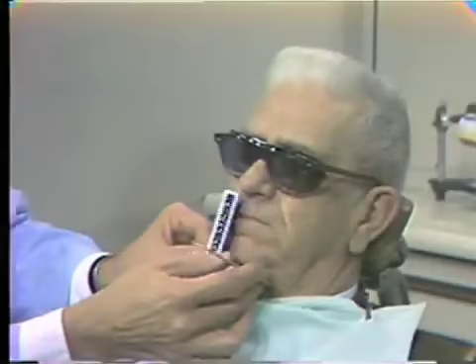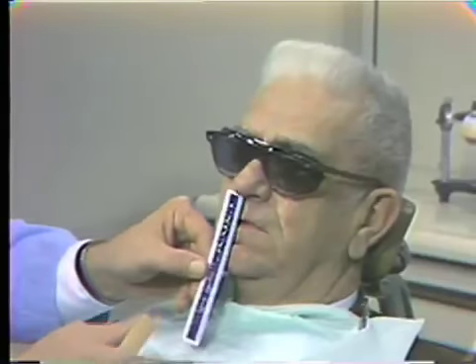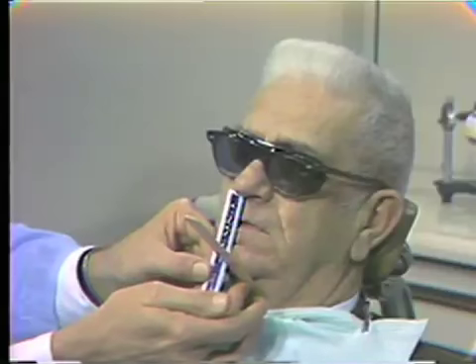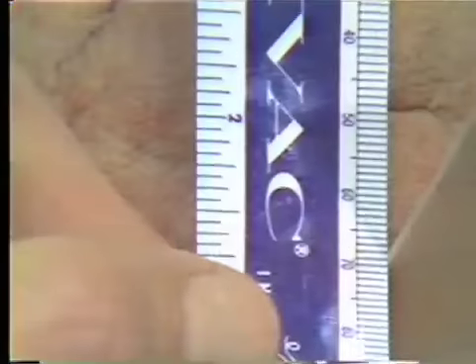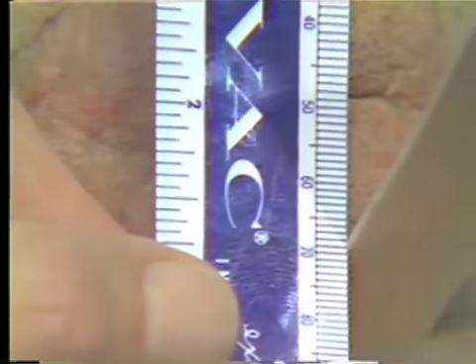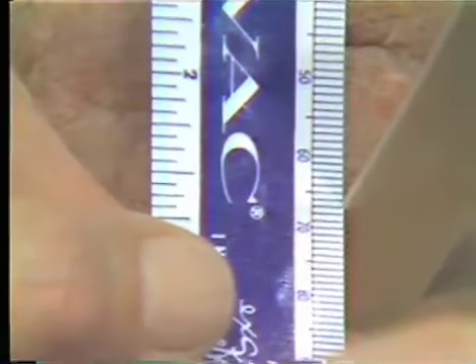Now we'll check to see how much interocclusal distance or freeway space exists in his old dentures by having him just open. Now open, Mr. Monahan. Just let your lips touch, just your lips. Now you can see he's in a comfortable resting position. This is equivalent to his physiologic rest position. Again, we'll place the millimeter rule, our tongue blade under, and we will read the dimension. As you see here, between 68 and 69. Now bite together. Now you see he's up at 66 again.